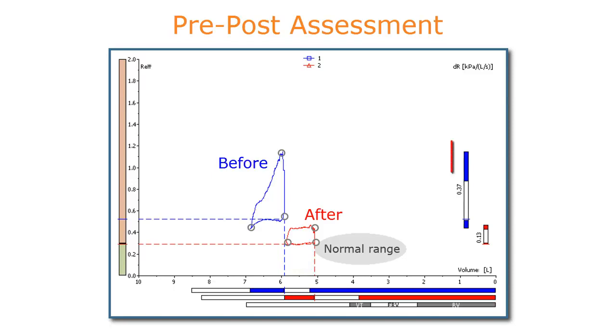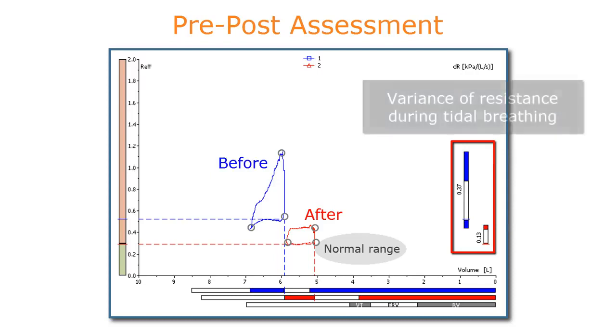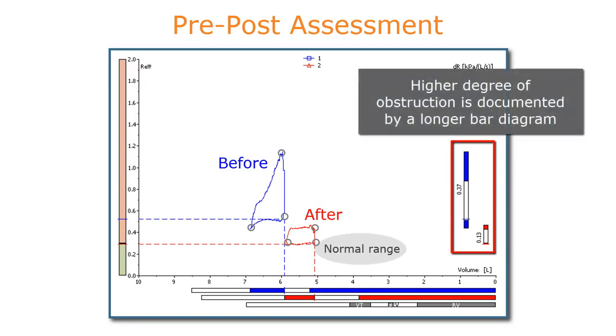The last feature we want to point out is the bar diagram to the right of the resistance-volume graph, which illustrates the variability of airways resistance during tidal breathing. A higher degree of obstruction is usually associated with greater variance of airways resistance within a breath, and therefore documented by a longer bar diagram.